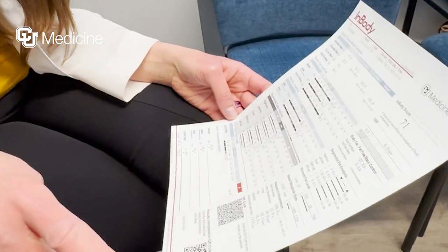It's a good tool because, depending on where you are in your menstrual cycle or your hormone journey, we see so many patients here in perimenopause and it's really helpful for them too. We're always talking about building muscle mass to help with general health, bone health, weight maintenance, and weight loss — and to actually have a way to measure this is really helpful.